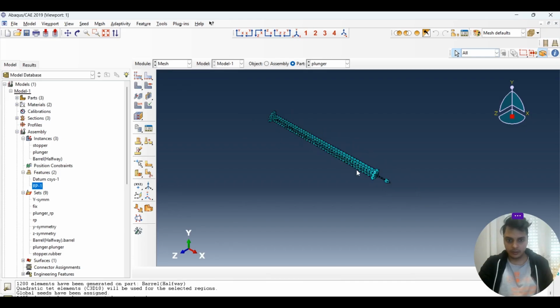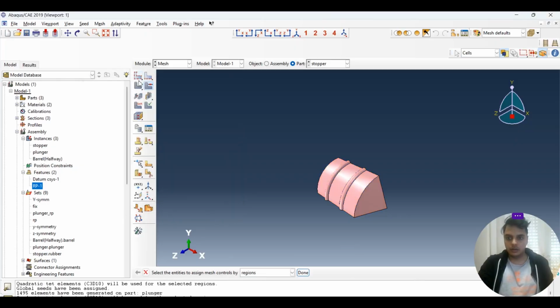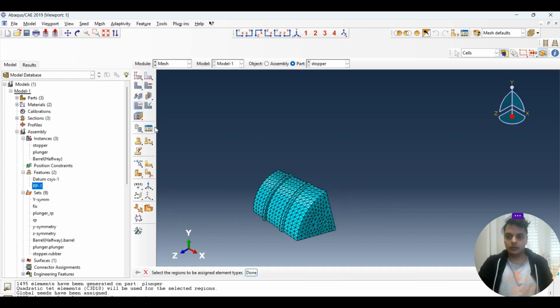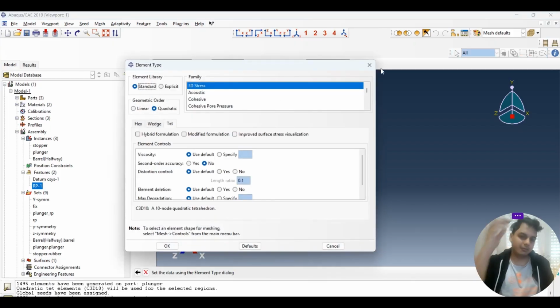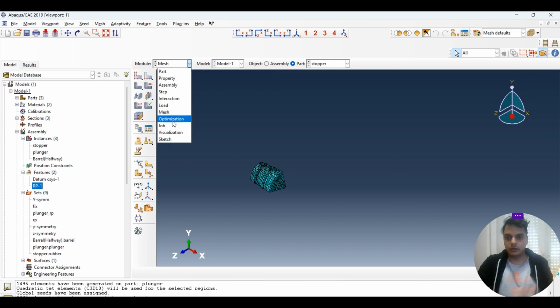This is what is defined here. Then the stopper. Again, either you do partition or simply do the tet mesh. That is okay, 0.5 is small enough, and I say okay. You can also play with this. I mean, let's say if I select, we can also play with the element type, but as of now I'm not so much interested in it. So everything is all defined.